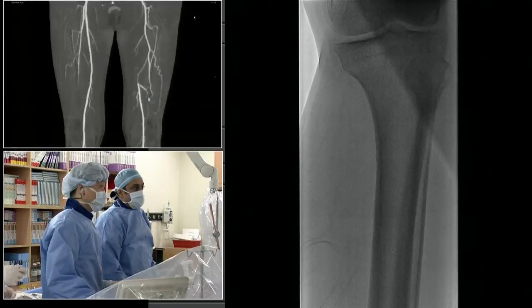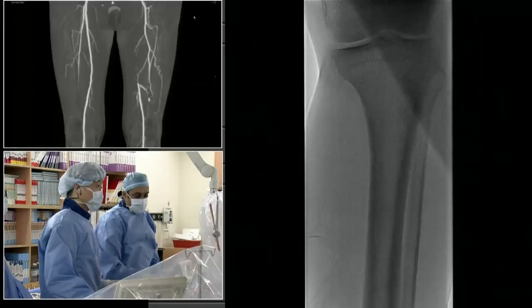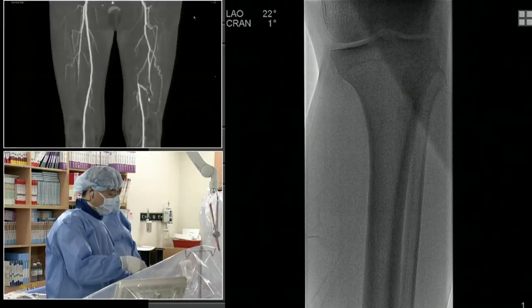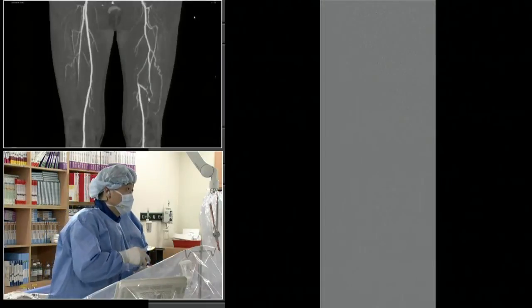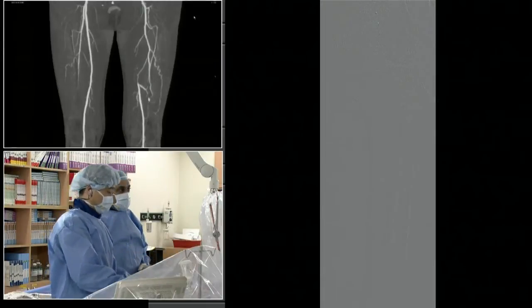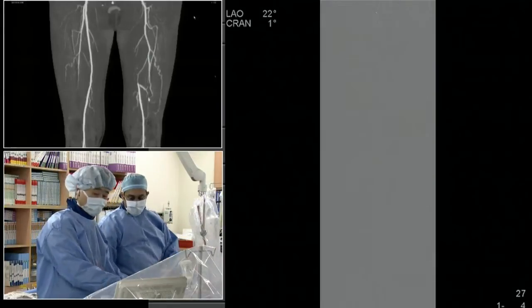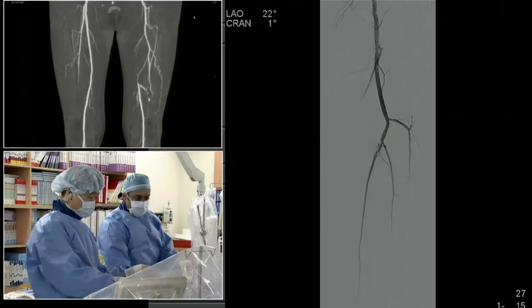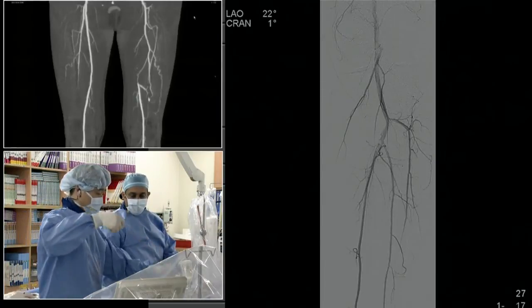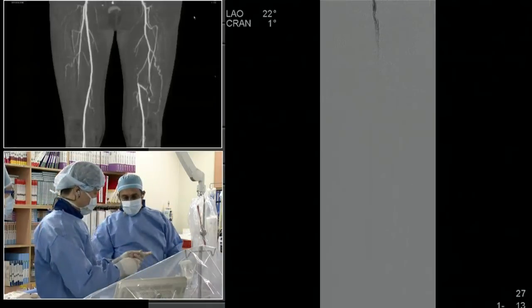Well, I don't fault the filter. You must have obtained a lot of plaque. DSA. Did you remove a lot of plaque? We removed a lot of plaque. We'll show you that in just a moment from the SFA, and the filter we're going to find in just a moment here. All right, great, so it looks good there. Let's get the filter retrieval, please. In the meantime, can we show the plaque that we removed, maybe on camera? I think there was a question about that.